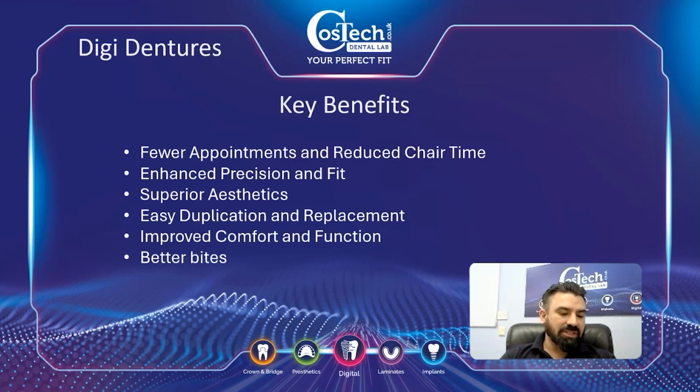Same as if you've got patients in care homes. One of our biggest sources of copy dentures is that they collect them all together, put them in one bucket to clean them, and then they're like, well, now someone else has got Mrs. Johnson's teeth. So if we actually have the file there, you can call us up and say, you've got the file, can you just reprint it? All the files will be kept for a year. After a year, we generally say you might have to start again because there could be even more change that's happened in the mouth, in the morphology, etc.